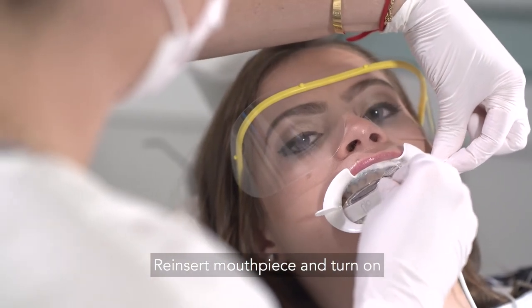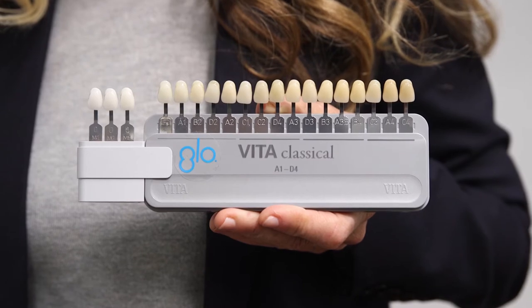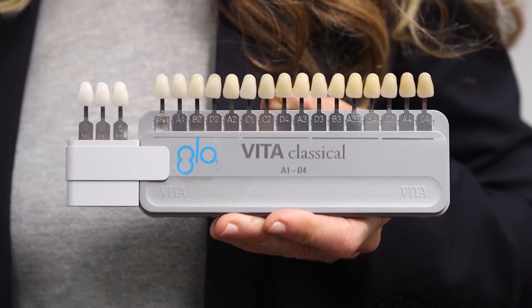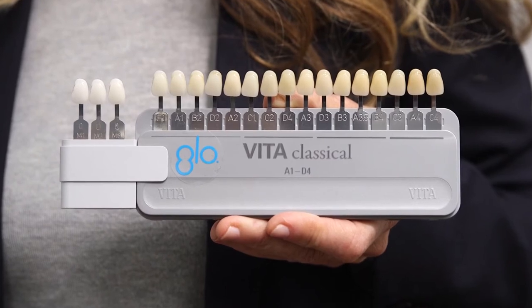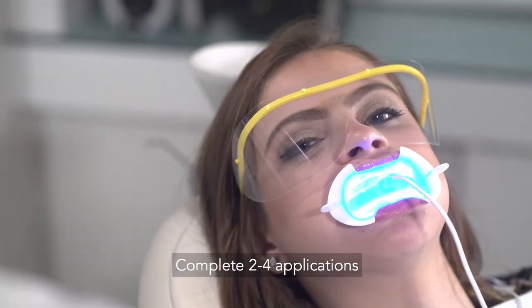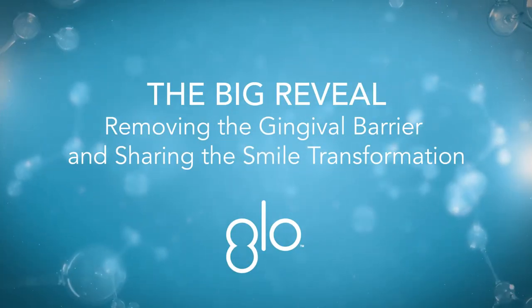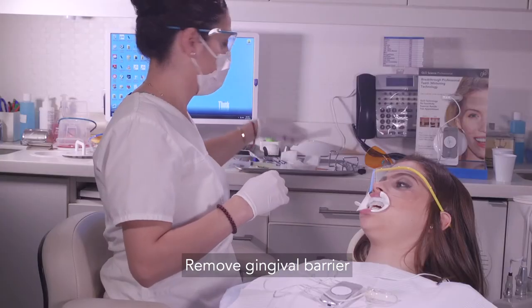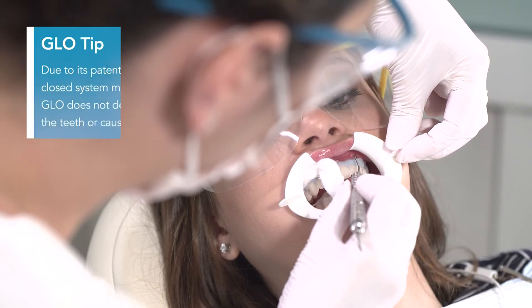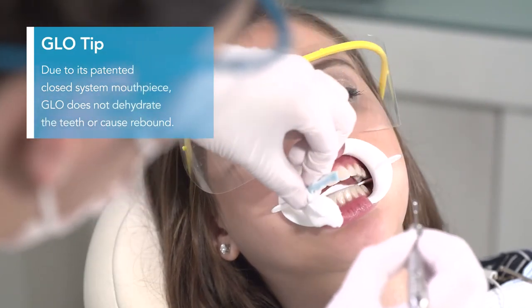Re-insert the mouthpiece and continue for another 8-minute application. Depending on the patient's starting shade, their desired shade change, their age, and their proneness to sensitivity, complete a total of 2 to 4 eight-minute applications. Loosen and gently remove the gingival barrier and gauze pads. The gingival barrier is very easy to remove and should come off in one piece.